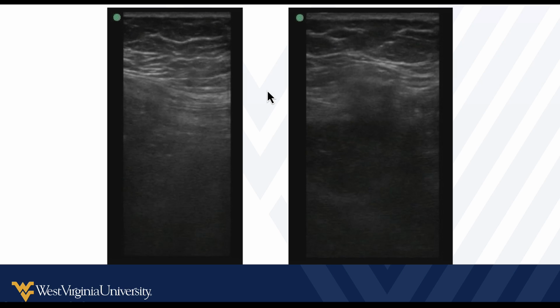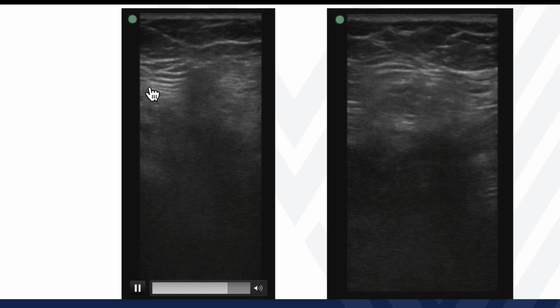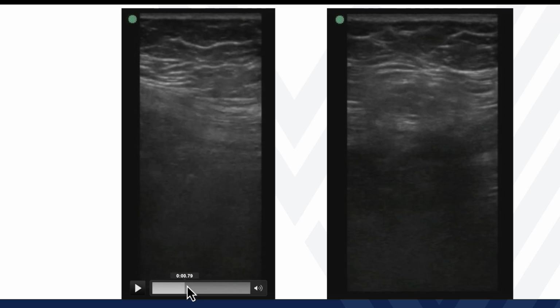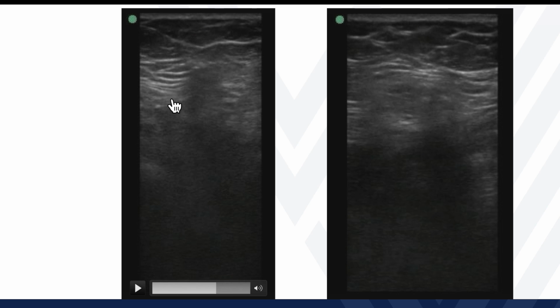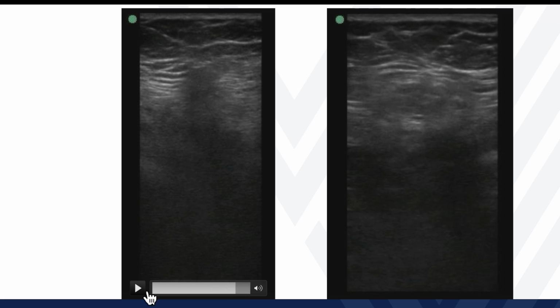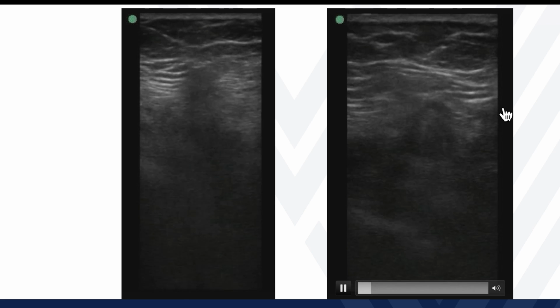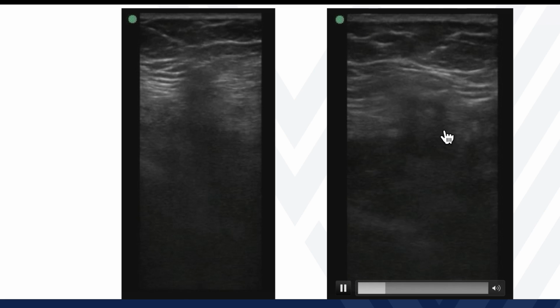This is a super subtle one, okay? But what we see in this case, here's the peritoneal lining, and as we fan through here, we see something violating it, and then we see loss of that peritoneal lining, and that's basically a little bit of omental fat peeking through. So this is just a fat-containing hernia. In this example, we see it a little more clearly. We identify the peritoneal lining, and then we just see something violating it, pushing through.